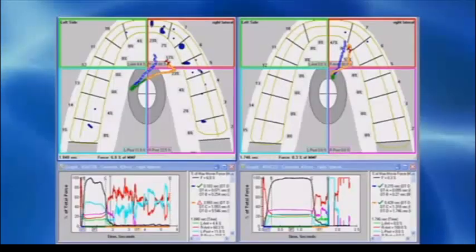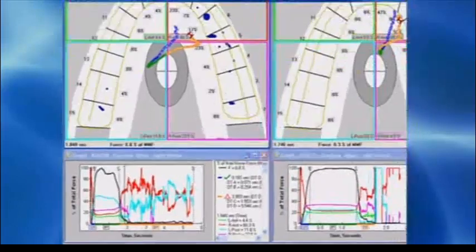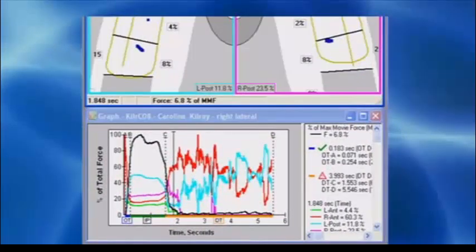In order to compare the before and after right or left excursions to each other, you need to look at how far into the excursion preoperatively compares to when the person discludes postoperatively. So here in movie 0.408. The timeline is to the right of C in the graph, 0.428 seconds, which is the actual postoperative disclusion time.